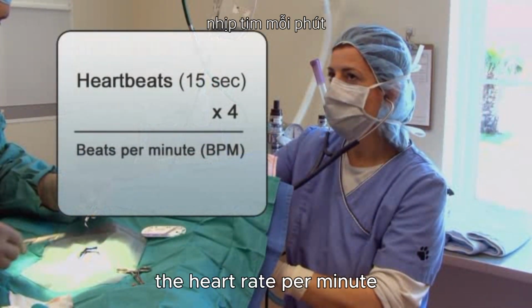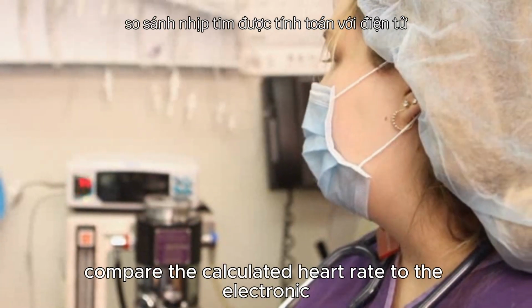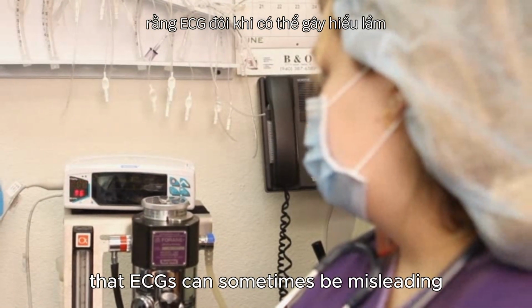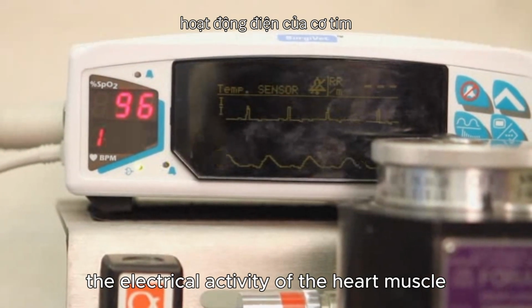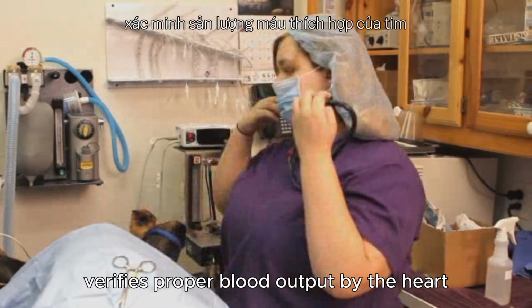The heart rate per minute is derived by counting the number of beats in 15 seconds and multiplying by 4. Compare the calculated heart rate to the electronic monitor's readout. It should be noted that ECGs can sometimes be misleading by only showing the electrical activity of the heart muscle. Evaluating the palpable strength and quality of the pulse verifies proper blood output by the heart.